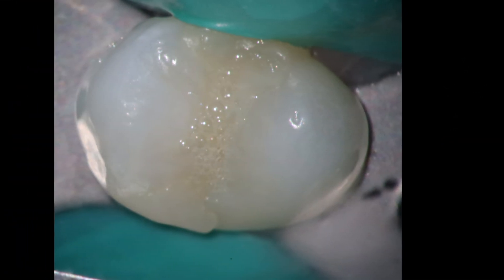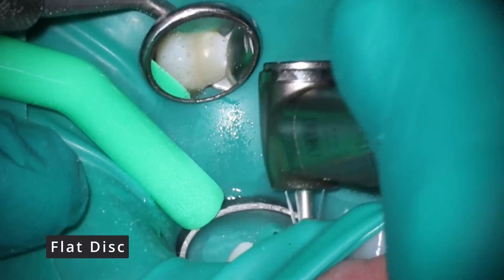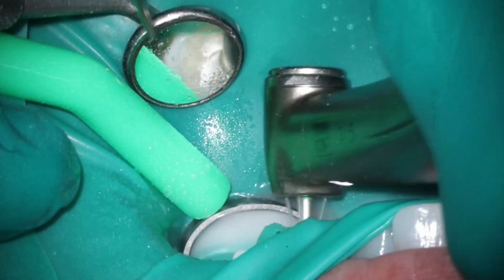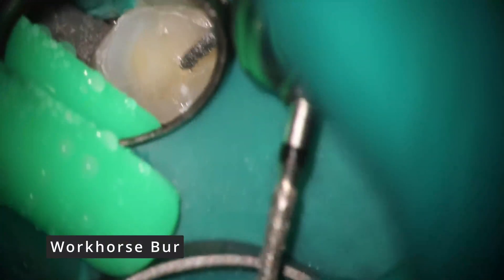As far as the access, it's pretty boring — just an MOD composite there. We're going to start off by taking the tooth out of the bite because it already has that MOD composite, and it's going to have a root canal, so I know it's going to get a crown. This is a good way to protect your work and minimize occlusal pain afterwards, as well as make it a little easier for the general dentist.